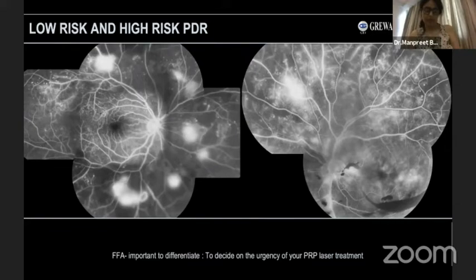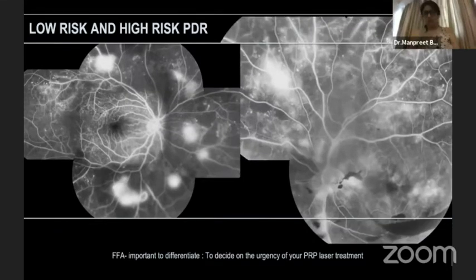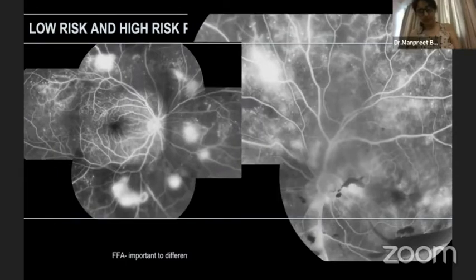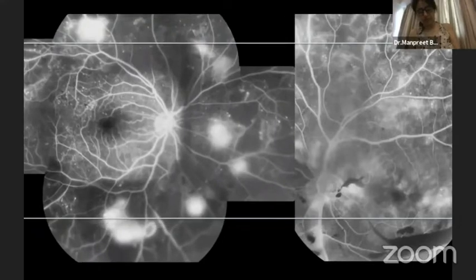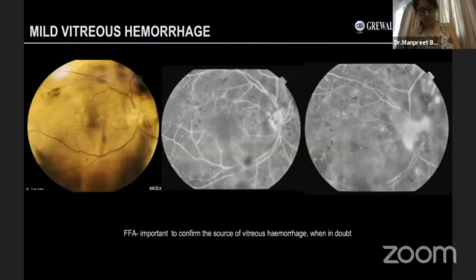Here, the patient had blocked fluorescence from a pre-retinal bleed with NVE seen in the superior nasal quadrant. This classifies it as a high-risk PDR requiring urgent PRP laser, whereas the other picture shows multiple NVEs in a case of low-risk PDR. In cases with mild vitreous hemorrhage, fluorescein also helps to confirm the source of the bleed.